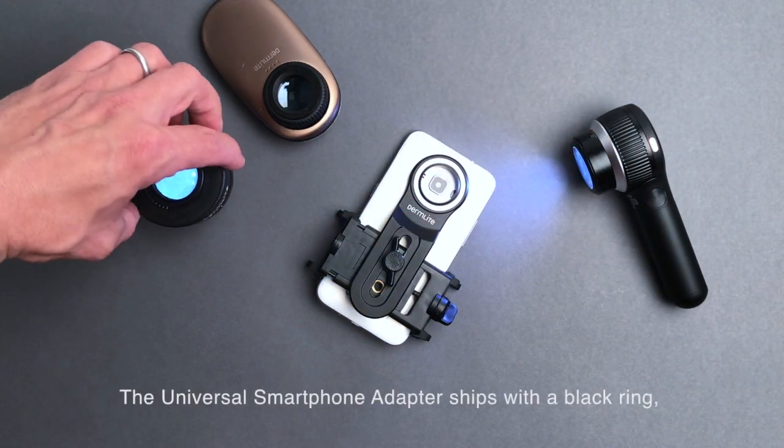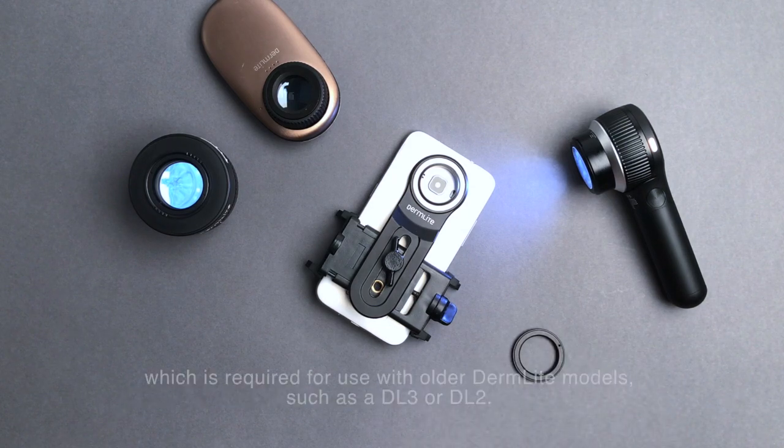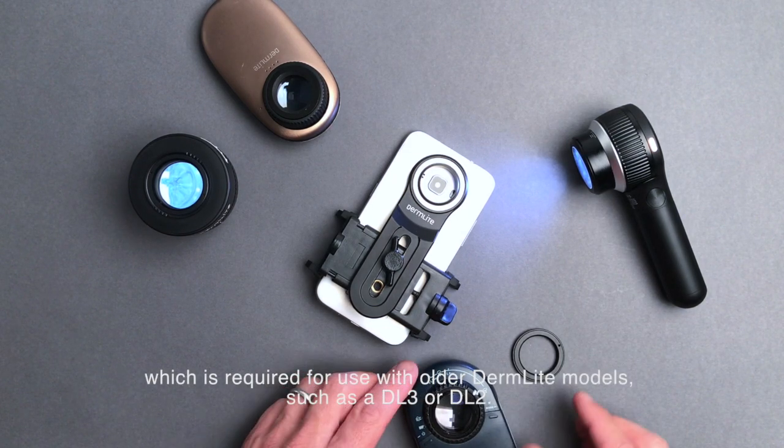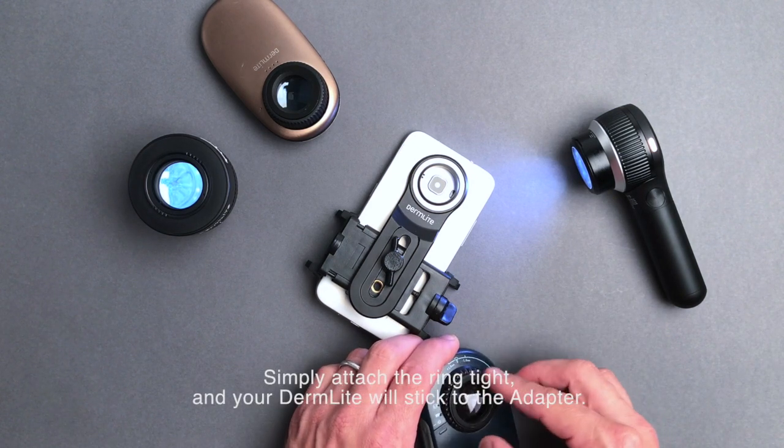The Universal Adapter ships with a black ring, which is required for use with older DermLight models, such as a DL3 or DL2. Simply attach the ring tight.